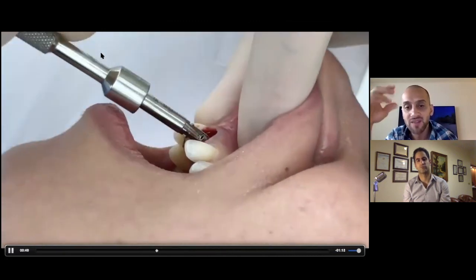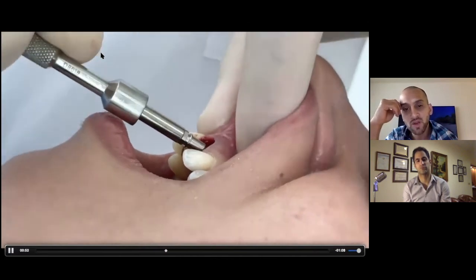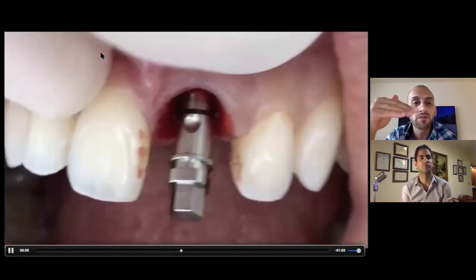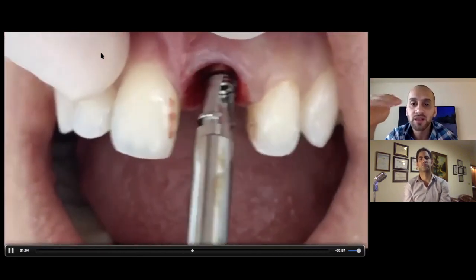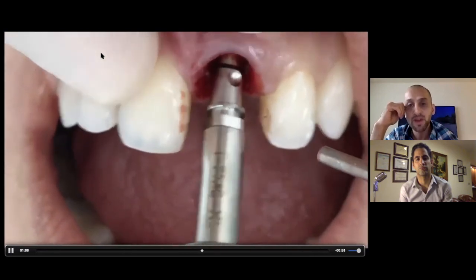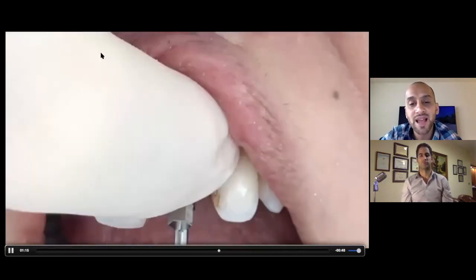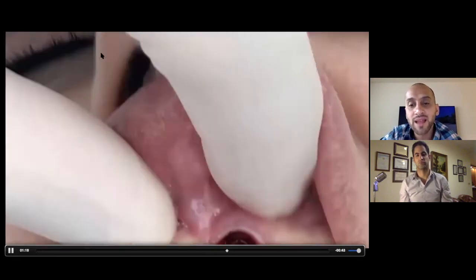So we're going to have to drive this implant deeper, and the dimple has to be placed on the buccal. We need to go deeper. That line has to completely disappear to make sure that the head of the fixture, the platform, is 3 millimeters apical. So we still have to go a little bit deeper because this fixture is not at the right place. So we go deeper, and then when we finish, we have to make sure that that dimple is centered exactly mesiodistally, and it's exactly pointing out to the buccal. We remove that, and that's the fixture right there.